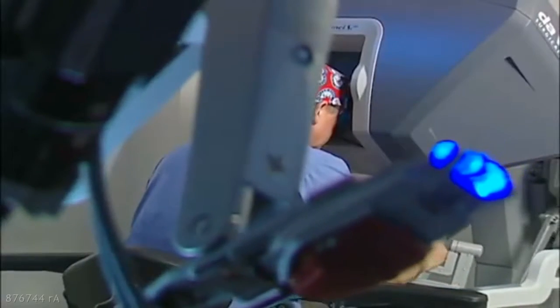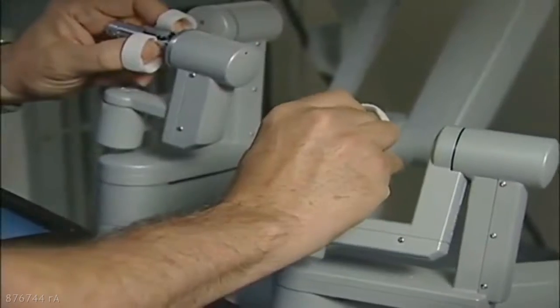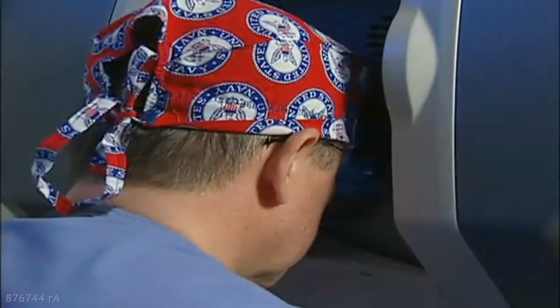I can use the controls at this station to guide the robotic instruments in any direction. A fiber optic camera gives me a very clear three-dimensional view of the space I'm working in.